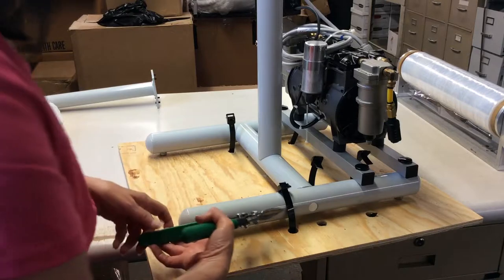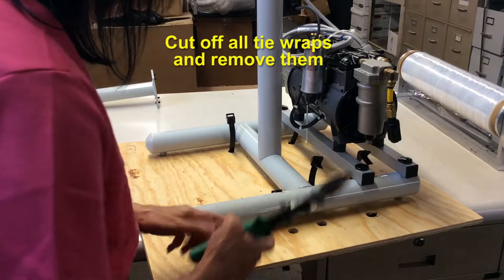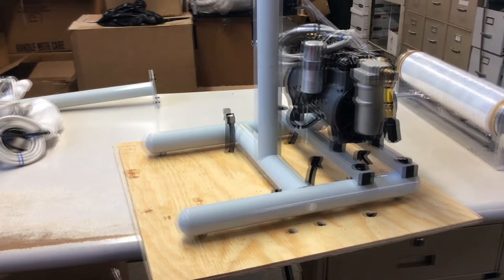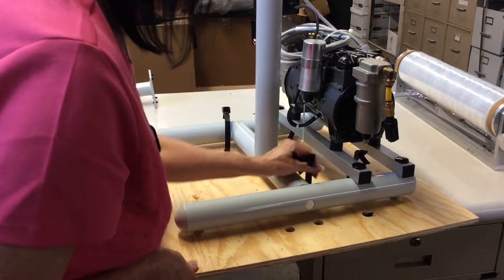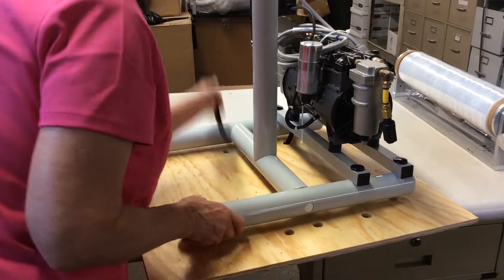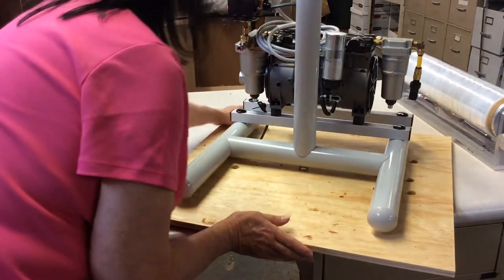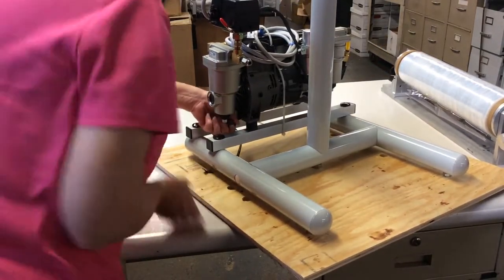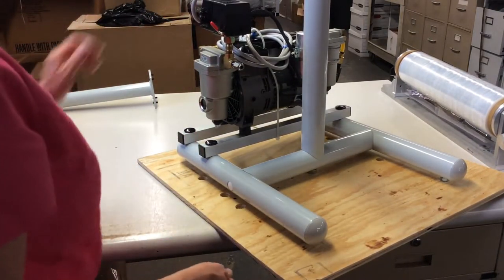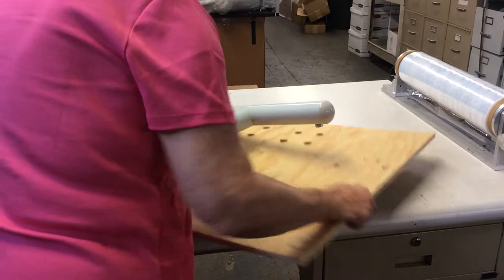Get yourself some very strong wire cutters and cut off the ties that tied the H-frame to the wood. Remove the ties and take the H-frame off the wood.